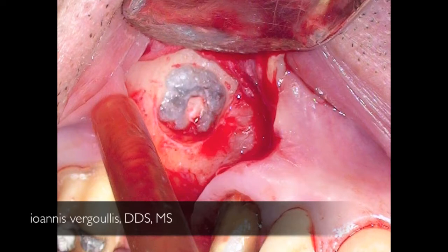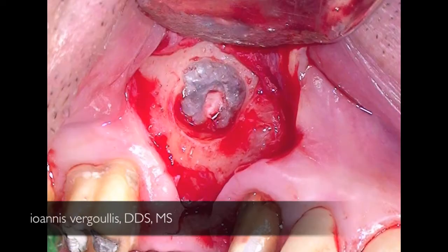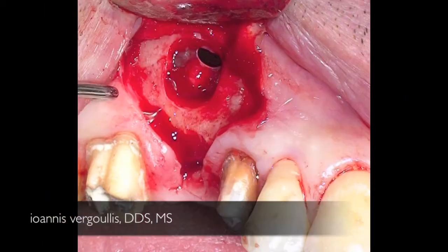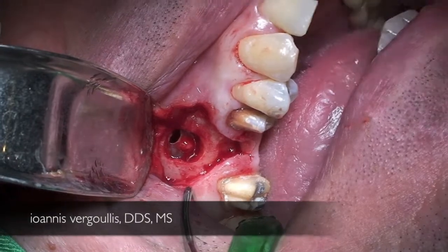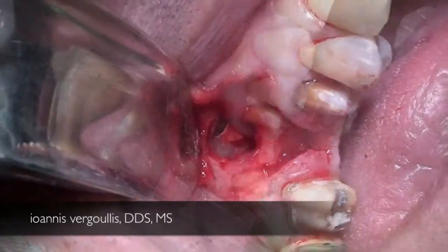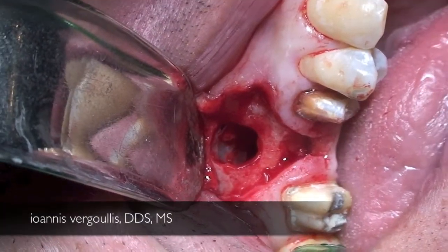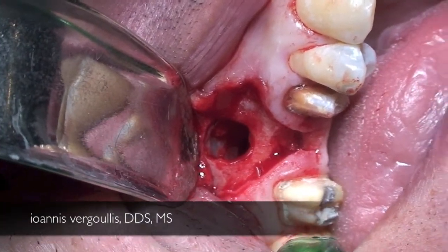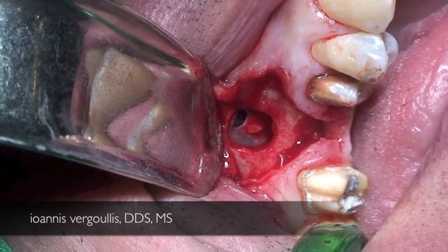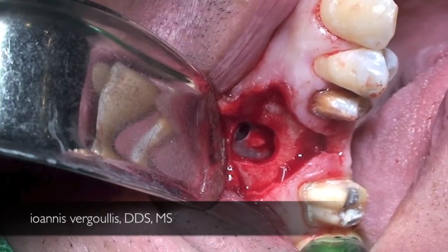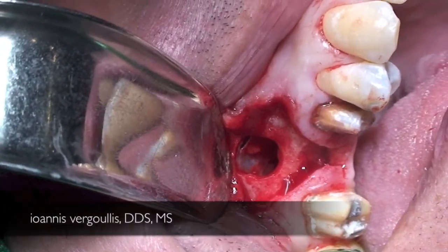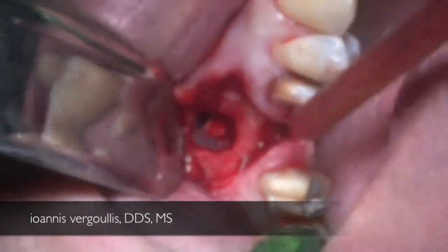We started with the window preparation and upon membrane lifting we got a small tear on the Schneiderian membrane. As you can see, when the patient exhales, the membrane moves — however this is not an absolute criterion to determine if there is a small perforation on the membrane or not.